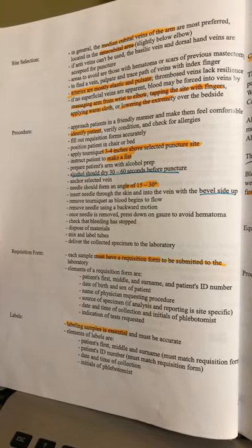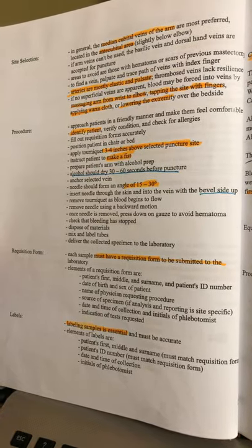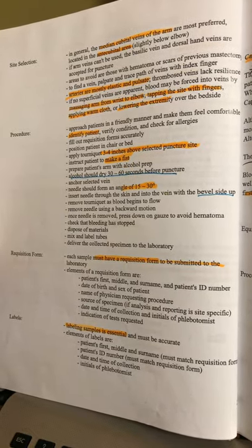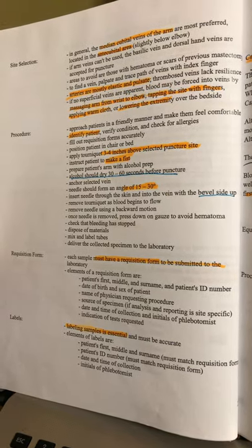Prepare their arm or clean it with alcohol prep and let it dry for 30 to 60 seconds. Make sure you anchor your vein — that means just hold it in place with your finger or your thumb. The needle should be at an angle of 15 to 30 degrees, with the bevel side up.